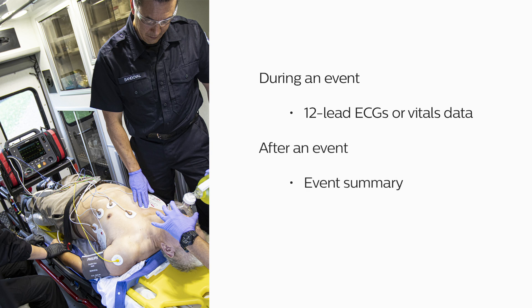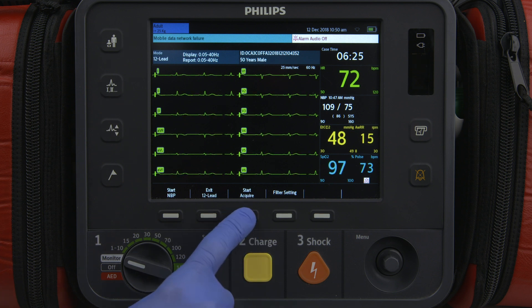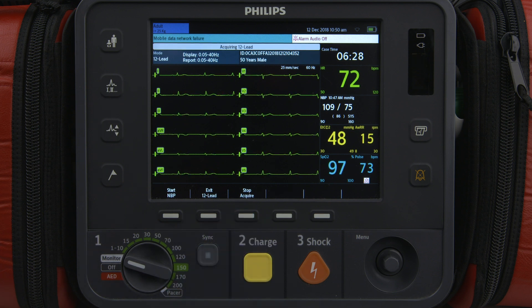During an event, you can send 12-lead ECGs or vitals data, while after an event you can send the event summary. Successful transmission of any data is dependent on a number of factors, including the availability of public or private telecommunications networks, as well as other factors that can affect cellular communications. The process for sending a 12-lead report and vital signs during an event is similar; we'll demonstrate using the 12-lead report as an example.